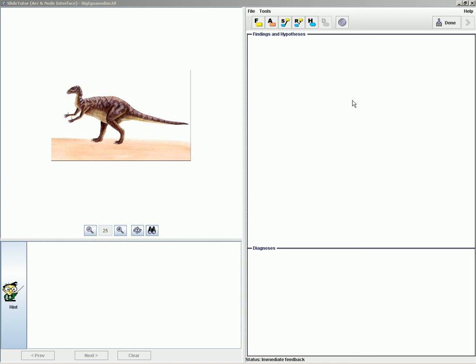You will switch back and forth between feedback mode, where feedback is provided immediately, and no feedback mode, where you must work on your own and no feedback is provided. You will be alerted by the tutor when you are switching from one mode to the other. There is also an intervening mode called coloring book mode, where you will be asked to reassess things you did while working on your own. So I'm going to show you each of these modes.